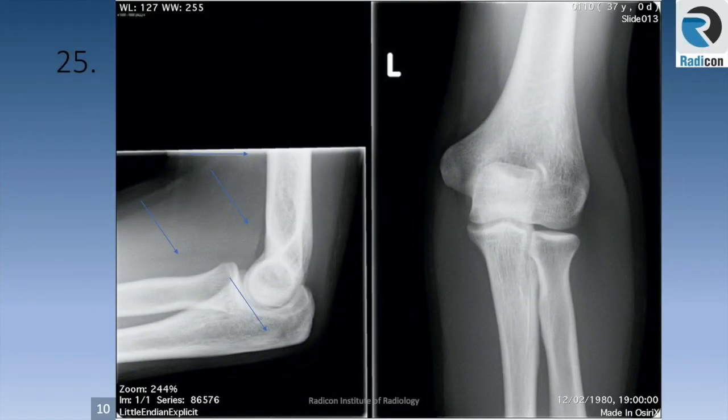Case 25: no fat pads, no joint effusion, no haemarthrosis, no obvious fractures, no soft tissue swelling. It is a normal film.